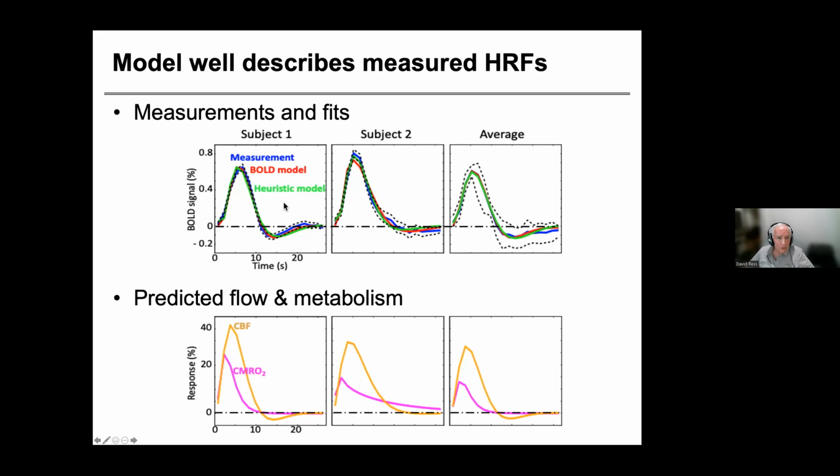And you'll see these 3 regions of colored dots, half brightly colored, half dark, for maximized contrast. And these 3 regions will go off in the last 2/3 of a second each, and they'll go off in a random sequence. So here the example is first yellow on the left, then red on the right, and then green in the middle. Your task is to push a button on a little response cylinder that's in your right hand as the regions of colored dots, which we colloquially refer to as fireworks, occur. So it's not a difficult task, but it requires a lot of brain function to do.